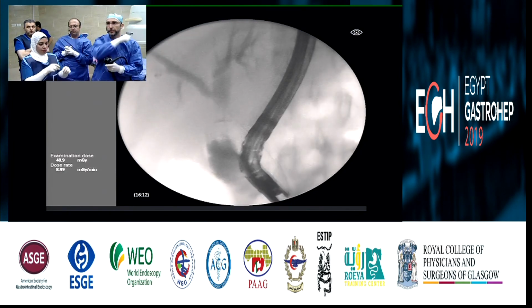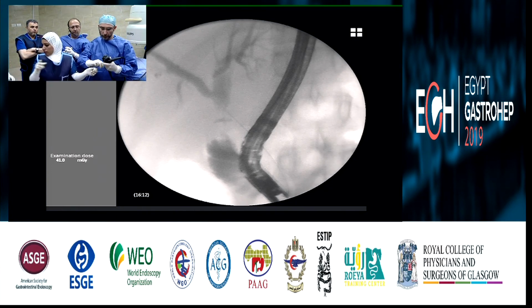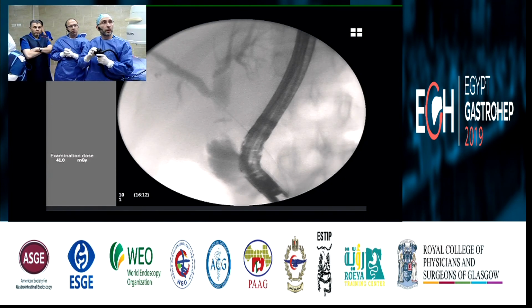Another argument is why not just use two plastic stents, one on the right and one on the left. That's a valid point. So what's the argument against that in this particular case, or is it just for demonstration purposes?